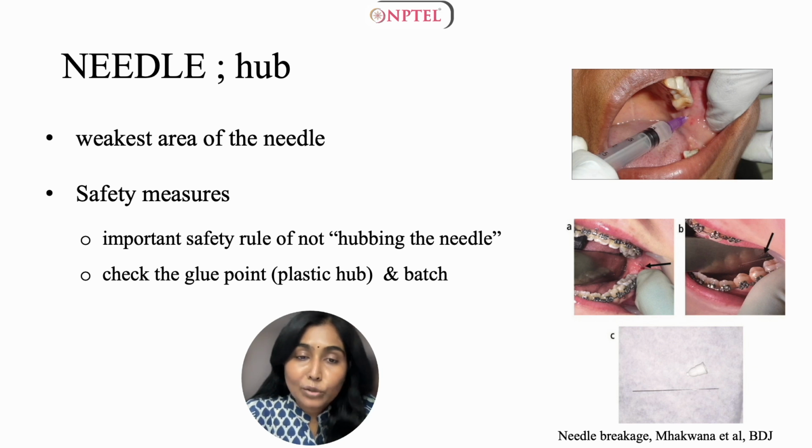Also, check for the glue point, especially with a plastic hub, and the batch also, because as it gets older, the glue point becomes weak and leads to disengagement.